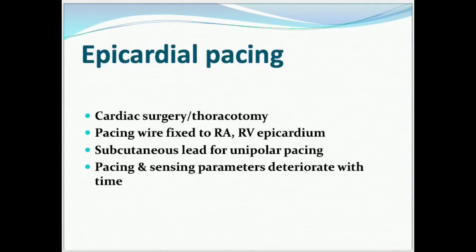Next, we have epicardial pacing. It is a preferred pacing approach during cardiac surgery because it needs thoracotomy. The pacing wire is fixed directly into the right atrium or right ventricular epicardium. Epicardial pacing is mostly unipolar pacing. Pacing and sensing parameters will deteriorate with time.